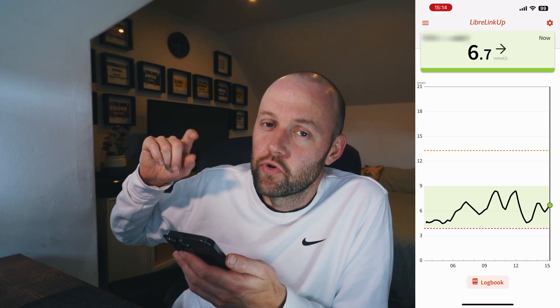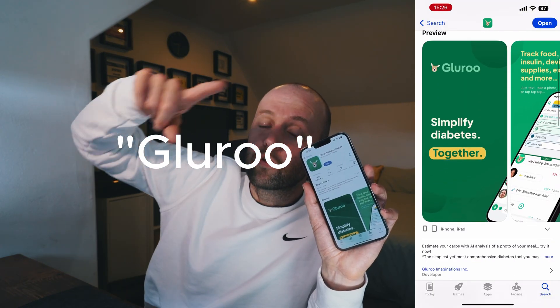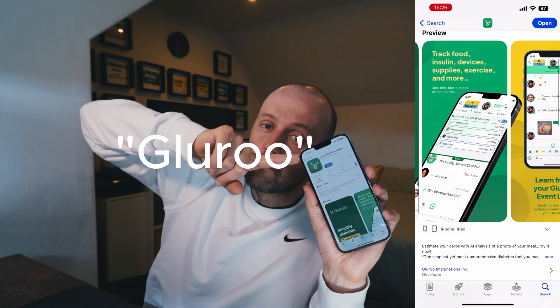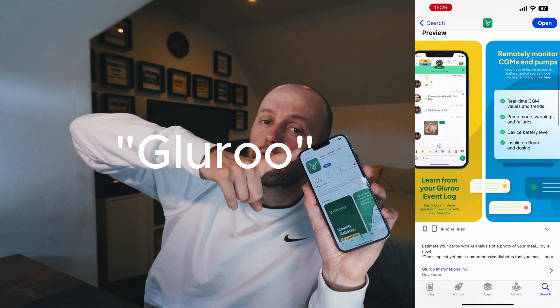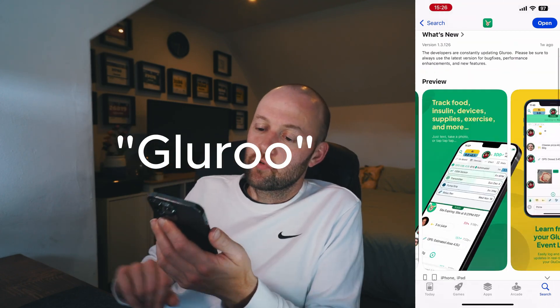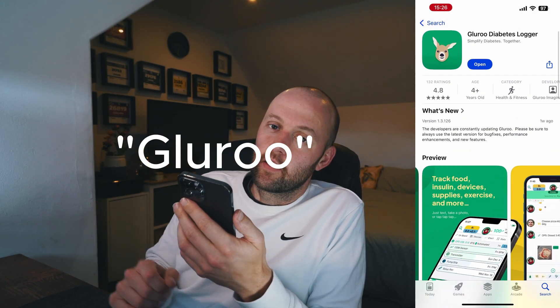So make sure you know your username and password because you're going to need to put it in the next app. The app you're going to want to download to display your blood glucose values on your phone is called Gluroo. Head to the App Store, type in Gluroo and click Download.